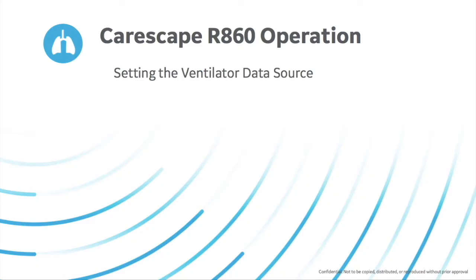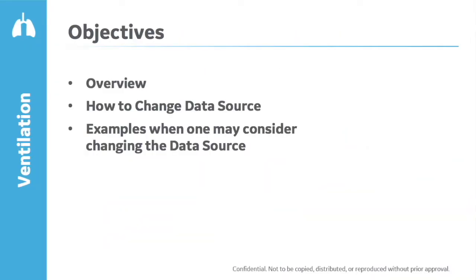The CareScape R860 operation, setting the ventilator data source. In this video, I'll be providing an overview of setting the ventilator data source, how to change the data source, and provide examples of when one may consider changing the data source.